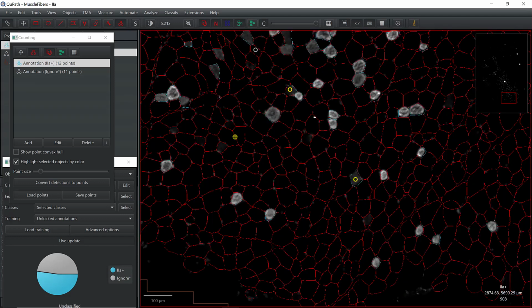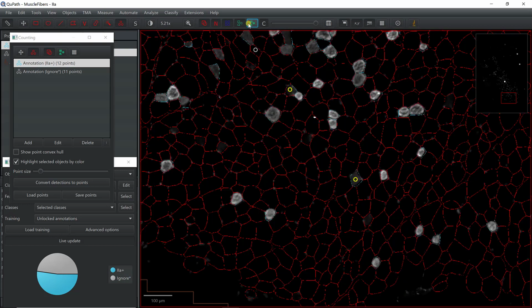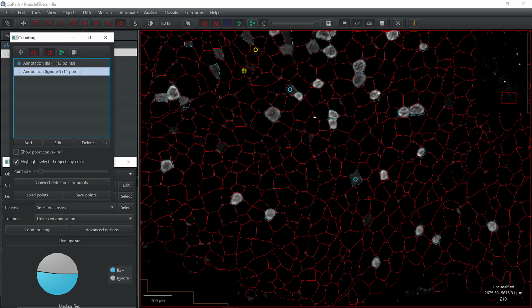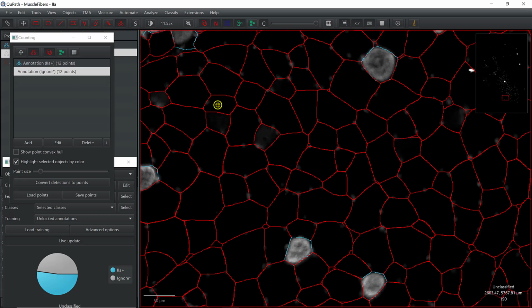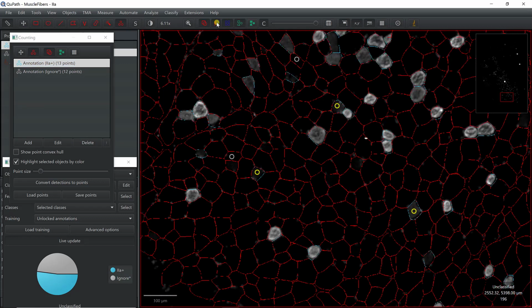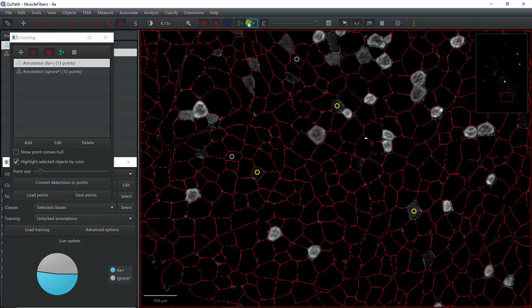So this one is positive as well. It's pretty good. So I have an unbalanced set of examples. So here we have other ones. Okay, so this is negative. I'm going to add this one, so we have to be careful that that helps. This is positive. This is definitely positive. And yeah, looks pretty good now.